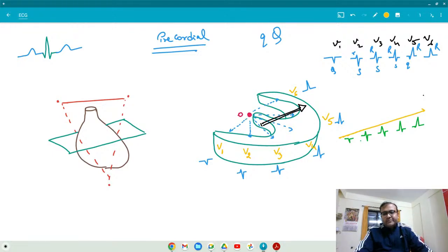So this is the idea. If you ever see somebody's ECG where this line is not moving upward, you check out, say, the chest leads. You have to check all the lines. You have to imagine over here that all the lines must be moving upward. You should understand that V1 this much, V2 this much, V3 this much, V4 this much, V5 this much. The line will move upward. Consider it is completely, absolutely all right. No confusion.